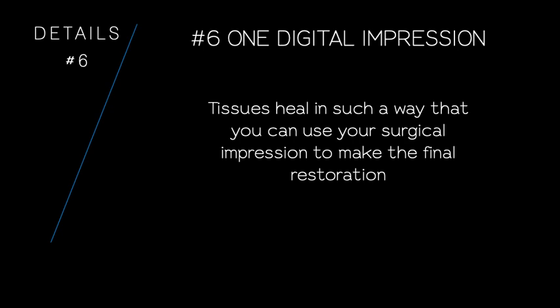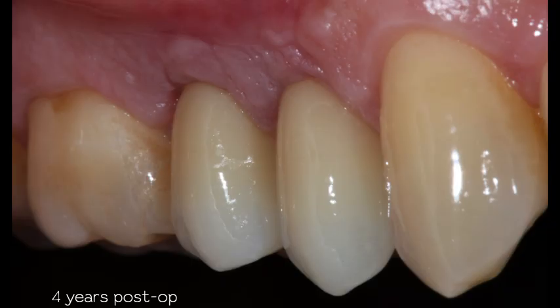So in most of my cases, I'm not doing this second impressions because the first digital impression, the one that he did on surgery, is more than enough for you to finish your cases beautifully. And this is 4 years post-op, as you can see.